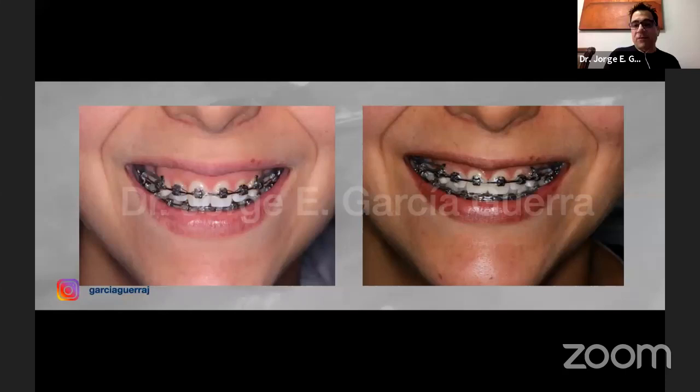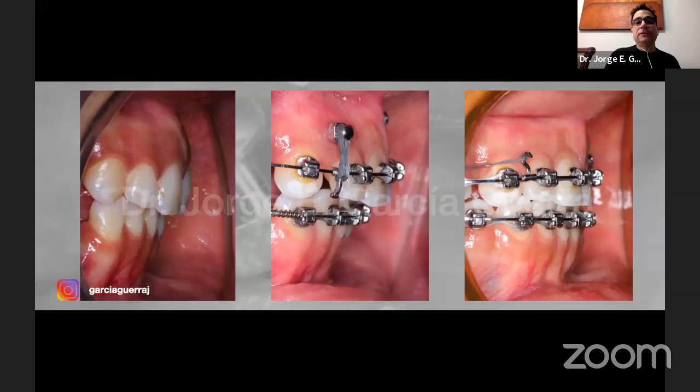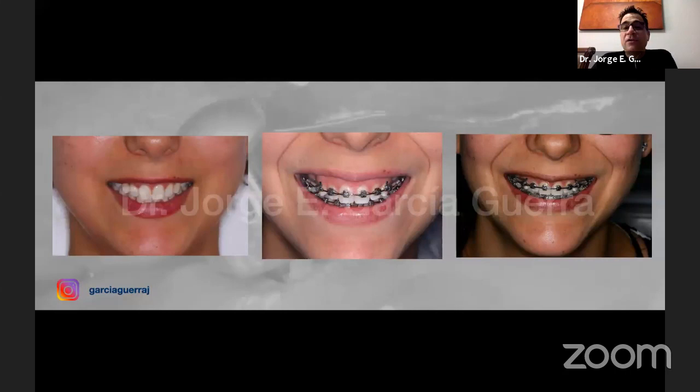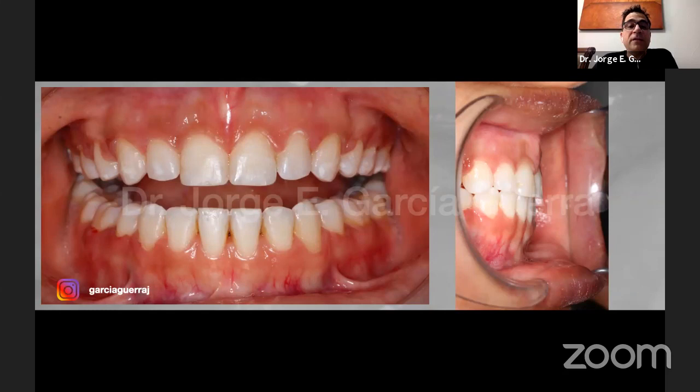Now you can see the beginning at the end. And the important thing here is to control the incisor inclination. Okay. You can see the beginning of the treatment and the progression and how it looks at the end. So this is the day we took the brackets off. We have some tissue inflammation there at the extraction sites, but we have a correct overjet, we have a correct overbite, and we have all of our spaces closed.